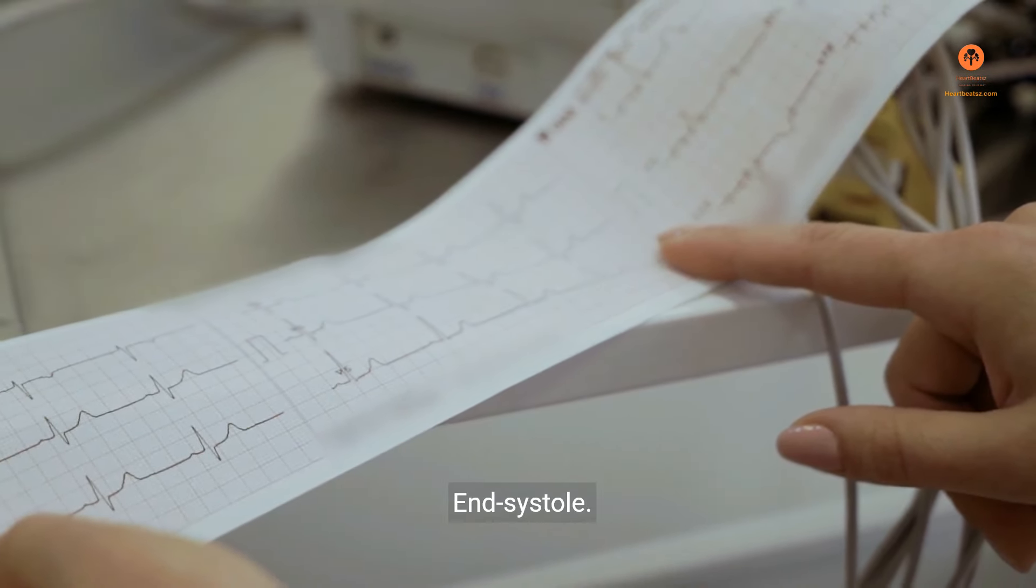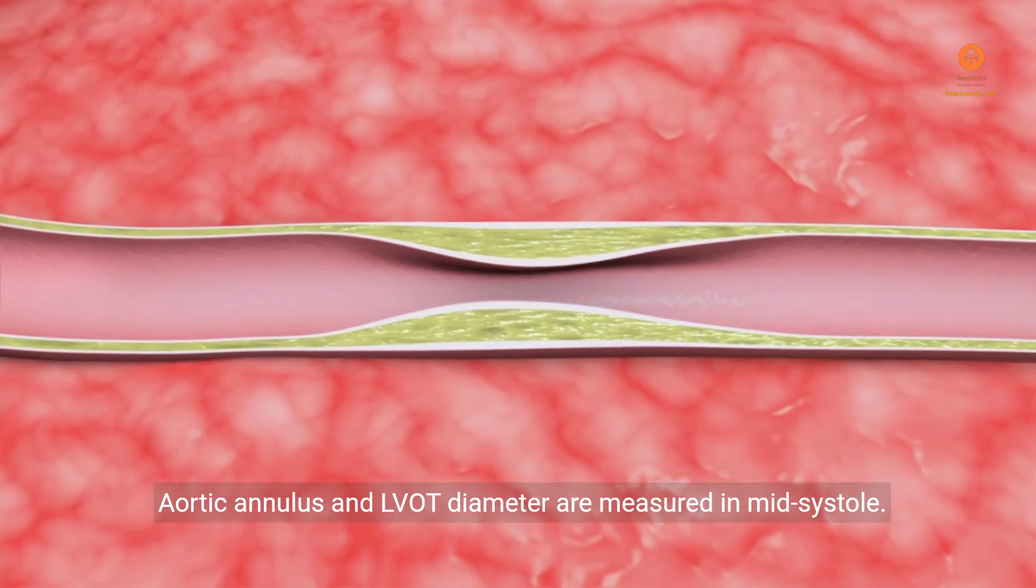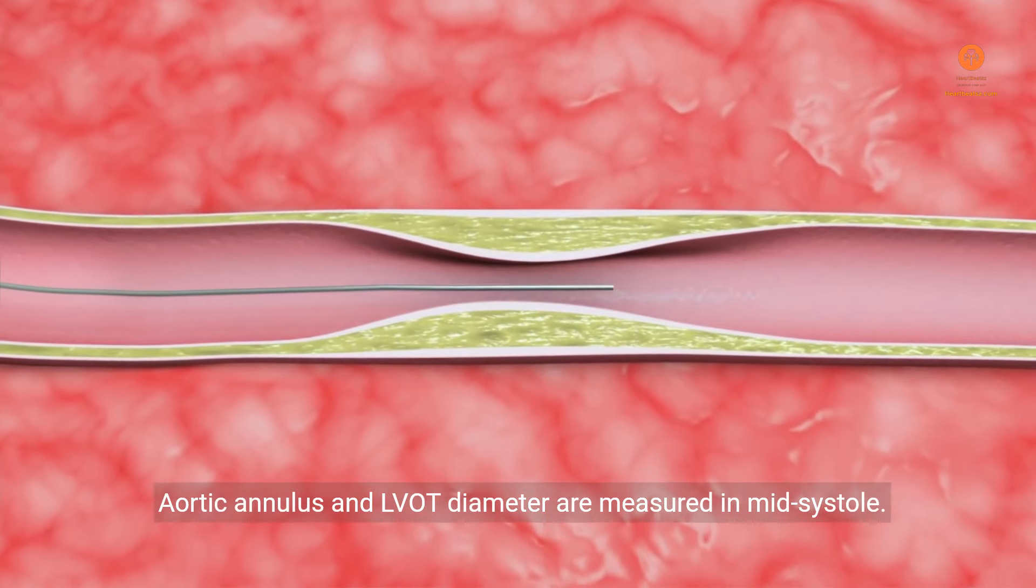LA is measured in end-systole. Aortic annulus and LVOT diameter are measured in mid-systole.